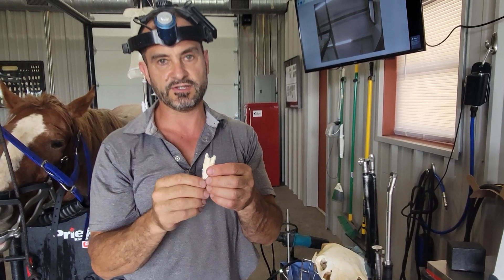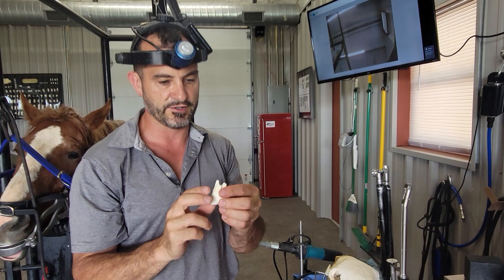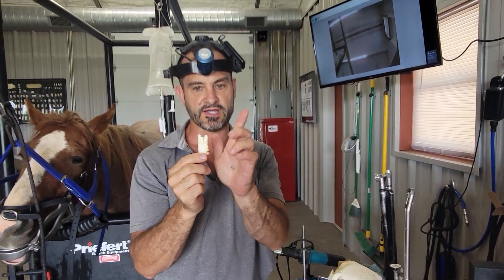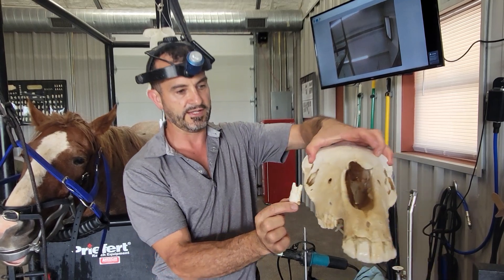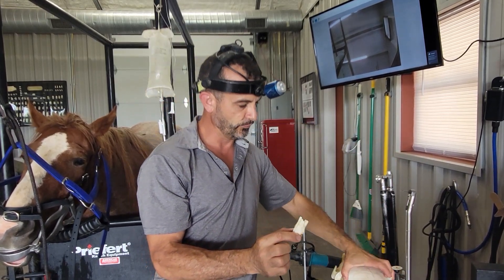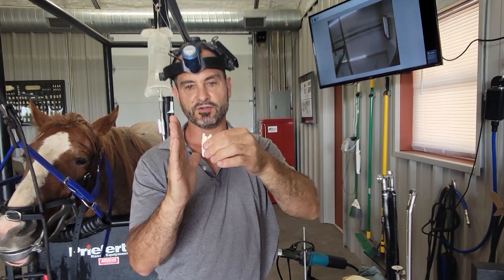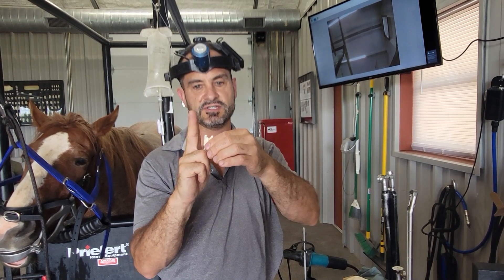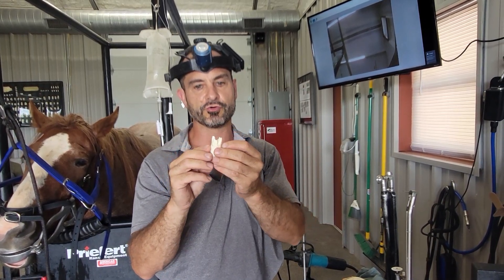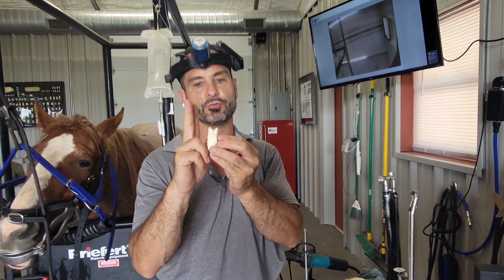Upper teeth — maxillary cheek teeth — have two buccal roots and one palatal root. So the 109 would have two roots on the outside and one root on the inside. When we do the generator over here with the plate receiver on this side, the two buccal roots get elevated and we can see them, but the palatal root drops and gets overlapped on the tooth — so we don't see the palatal root on that view.